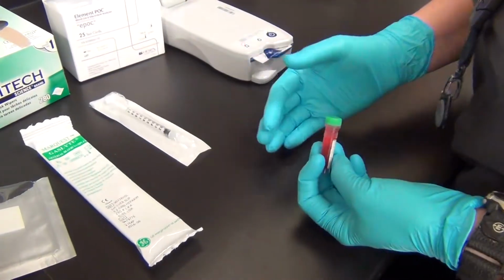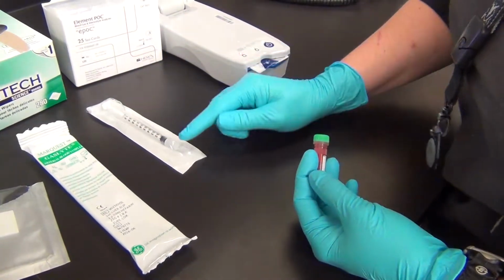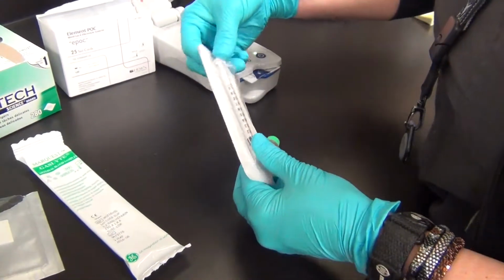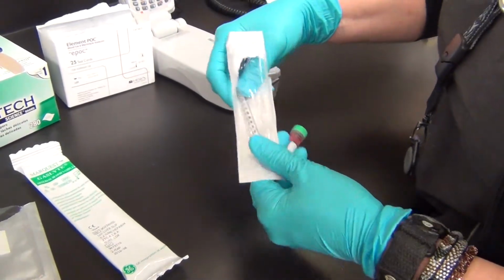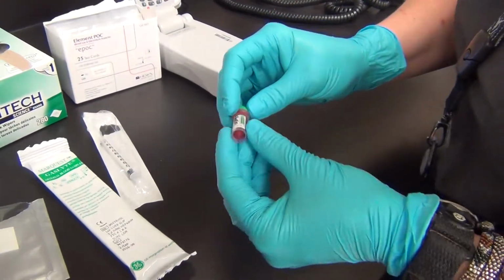In that case, to load the sample into the analyzer, we can't use pipettes. So we're going to be utilizing syringes, and they need to be luer lock or luer tipped syringes: a tuberculin syringe without the needle, or a 3cc luer locking syringe with the needle detached.